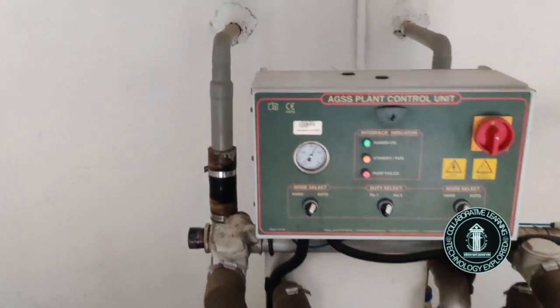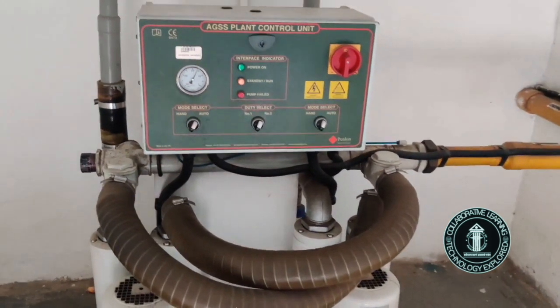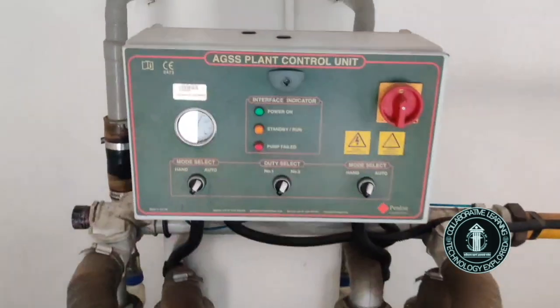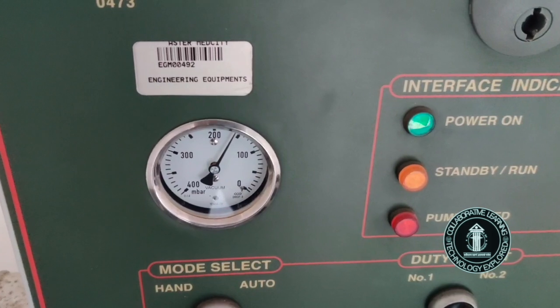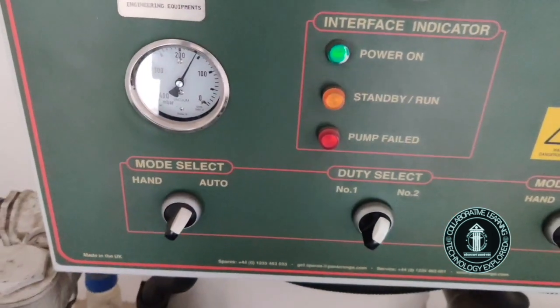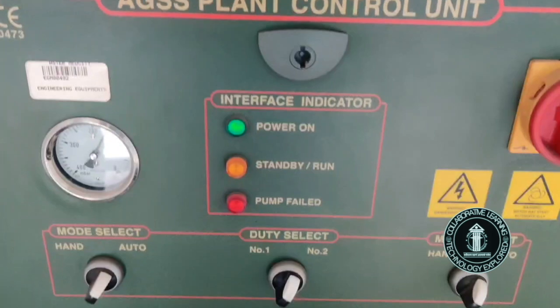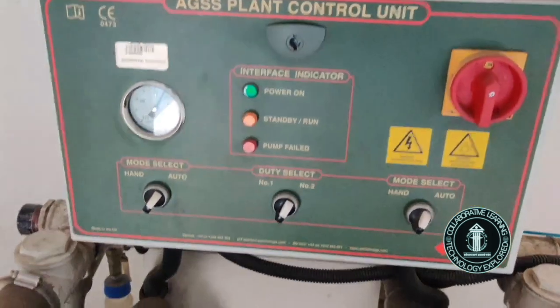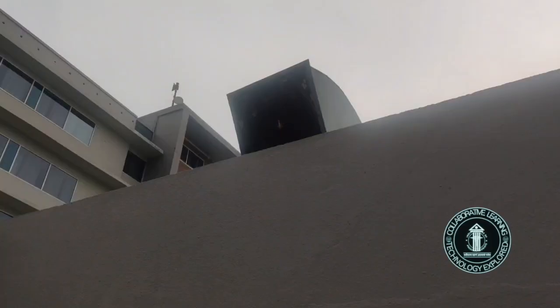There is an electrically driven motor. There are ducts to collect the gas from the transfer system, as well as ducts to vent it outside. There is a control panel, and the main part is a mechanism to create a low vacuum or suction. This will create a vacuum or suction, and the amount of suction or vacuum that is regulated is shown on the pressure gauge. Then this will pull the excess waste gas from the collecting system through the transfer systems to this final disposal unit. There are options for auto control and manual control, motors which are electrically driven, and finally ducts to vent it outside. That is in brief the AGSS.